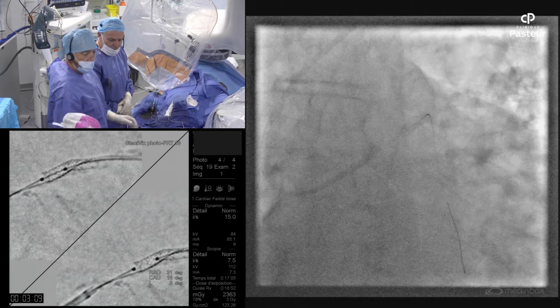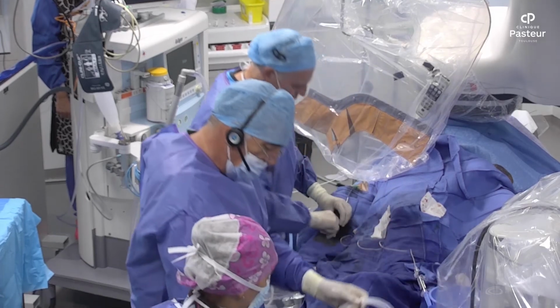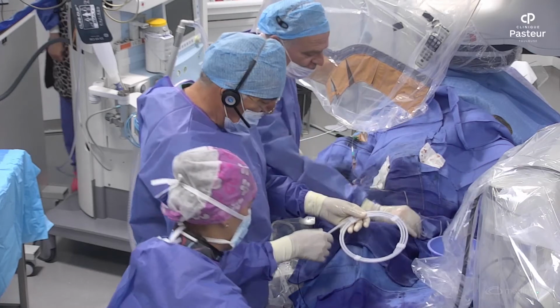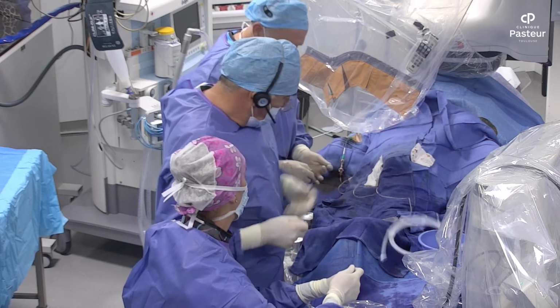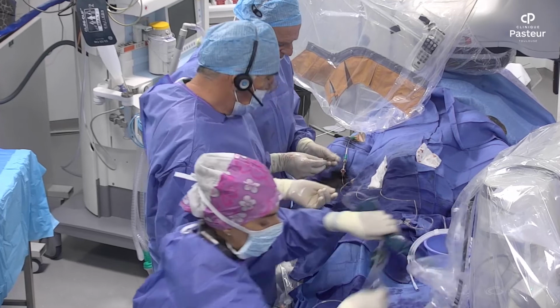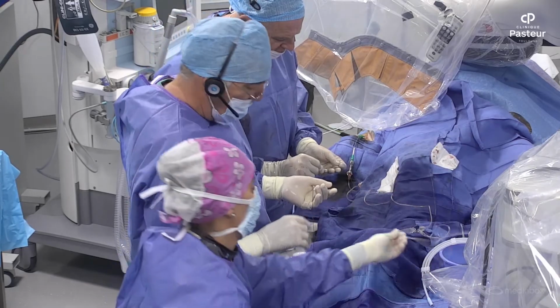So we have the OCT probe. It could be an evaluation by IVUS. It could also be discussing to do FFR. The evaluation of the left main is sometimes difficult just by angiography, and some tools like the intracoronary imaging or the physiology test would be very helpful.